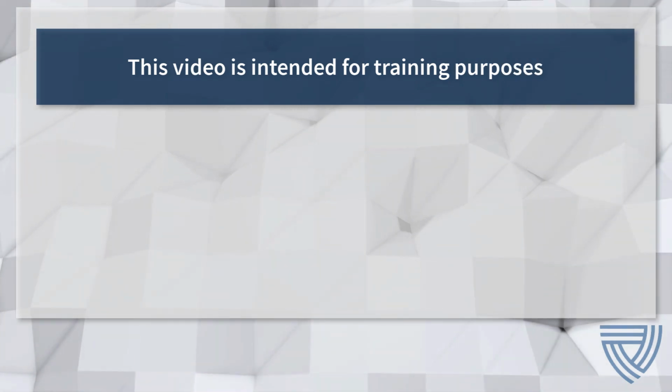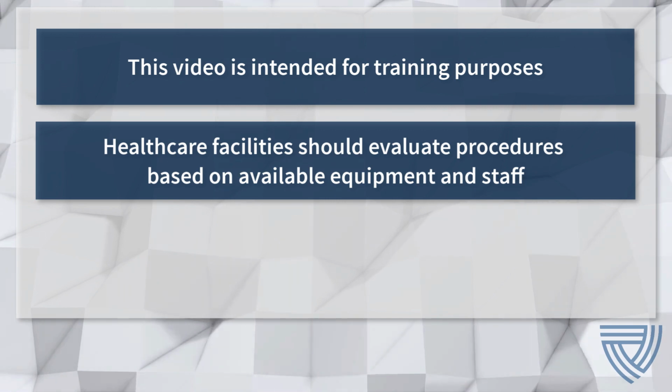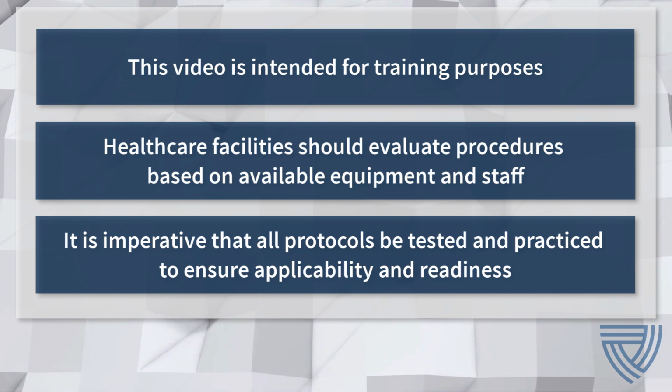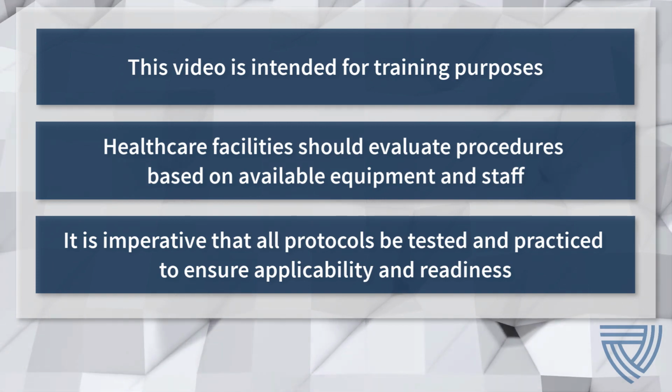This video is intended for training purposes. Healthcare facilities should develop procedures based on available equipment and staff. It is imperative that all protocols be tested and practiced while wearing personal protective equipment to ensure applicability and team readiness.